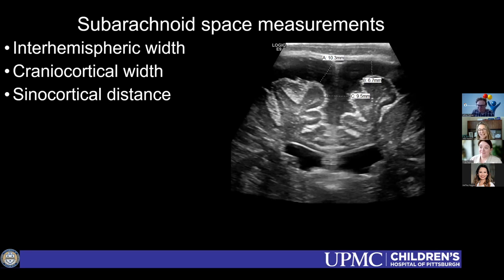Subjective. Yeah. My bias is I hate measuring. I feel like we measure things at ultrasound that we never do on CT or MRI. So why are we measuring all these things? But that's what I do.